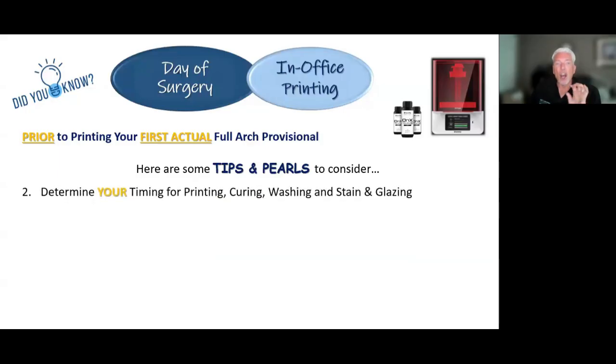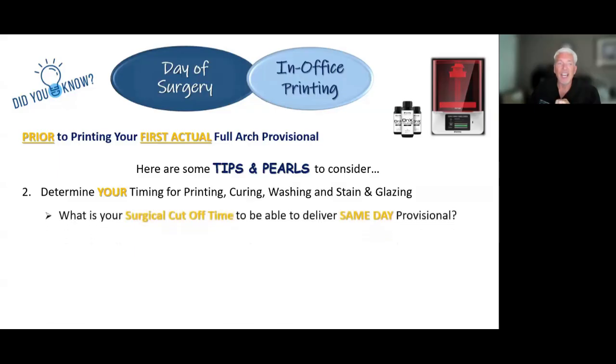Again, you need to know what your time is for printing, the curing, the washing, the staining, glazing. Who's going to do it in your practice? Are you going to do it? Is that cost effective for you to do it? Then what is your surgical cutoff time to make the lab's time?